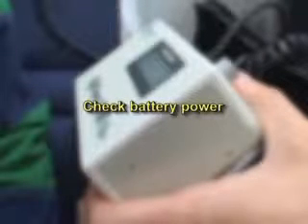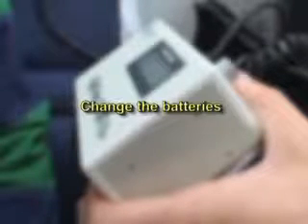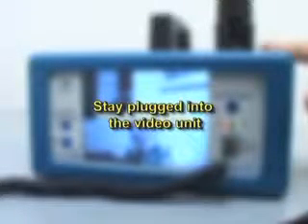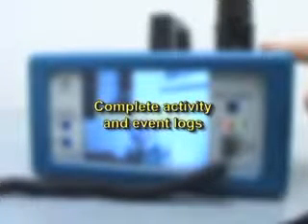Check battery power periodically. Change the batteries when battery power is at 75% of power. Make sure you can be seen in the display on the video unit. Stay plugged into the video unit with a coiled cord as much as possible. Complete the activity and event logs and bring them to your disconnect appointment.